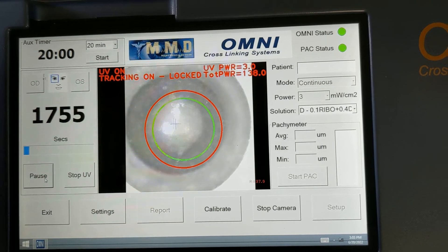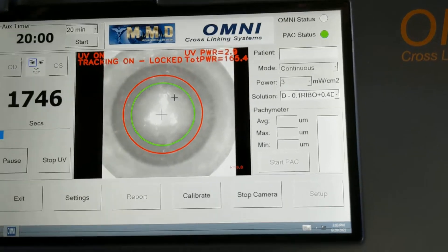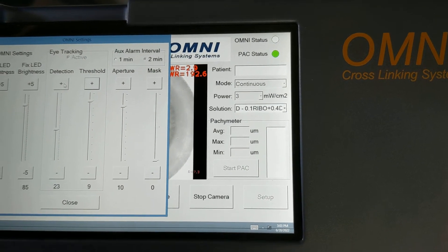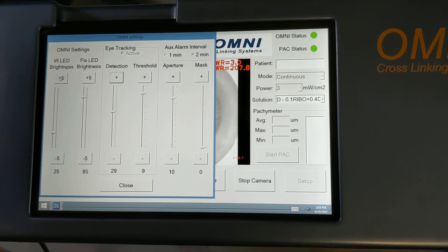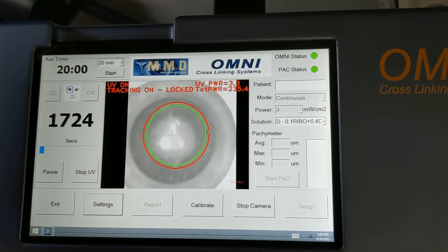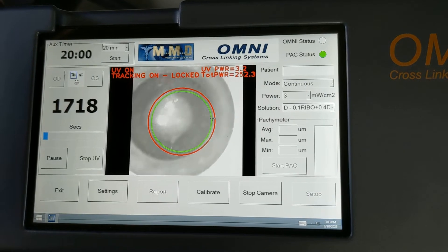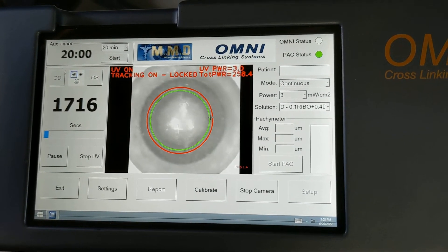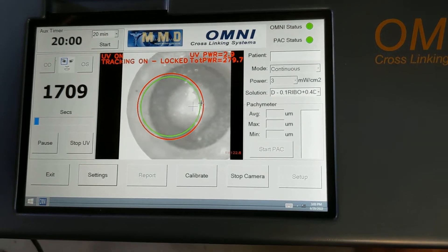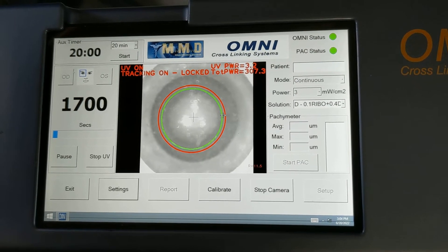The tracking is working on the eye with those threshold levels. If you're having problems with tracking, you can make the green circle larger, change the threshold bigger or smaller, adjust the detection level up or down, and also play around with the IR value. With the threshold bigger, it's now looking for a circle on a bigger area — so you can have a little more movement on the eye before it pauses.